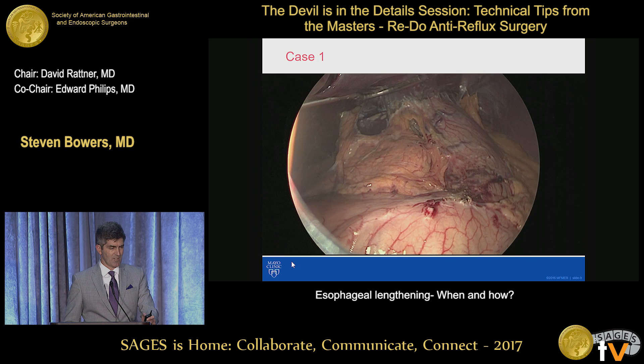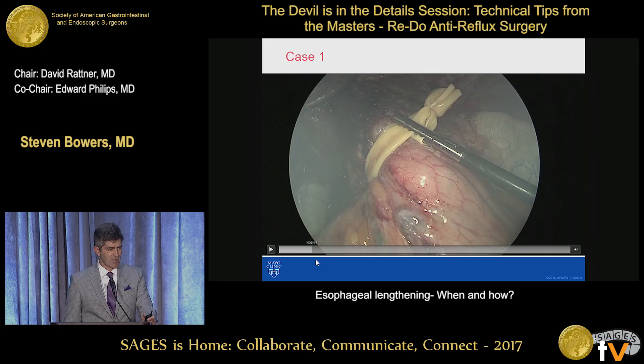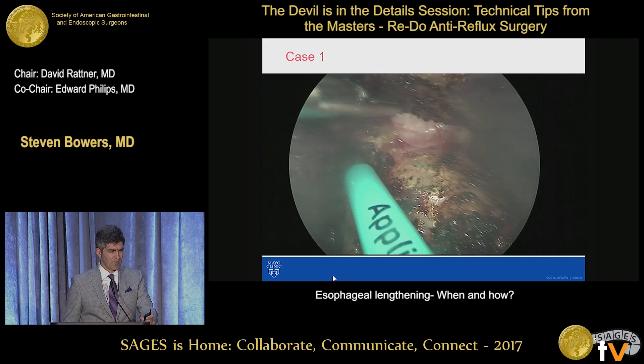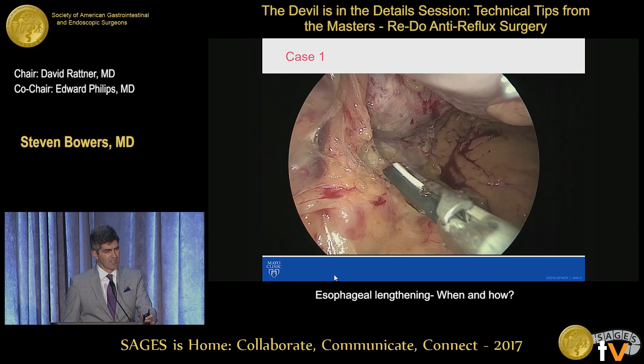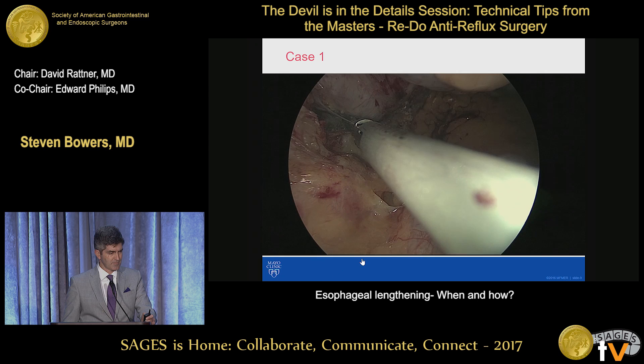So at revisional operation — this is a third-time operation — we approach that in much the same way as all of our redos: taking the liver off first, getting a Penrose around the hiatus, and then getting in to do the hiatal dissection. This is always very difficult at the third time, but it's something that you have to be very careful about. I like to use scissors rather than the ultrasonic shears for this. This is going to the base of the left crus, and we try to expose the base of the left crus and take the prior fundoplication off the left crus pillar.